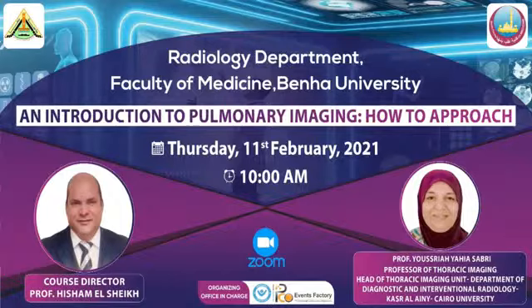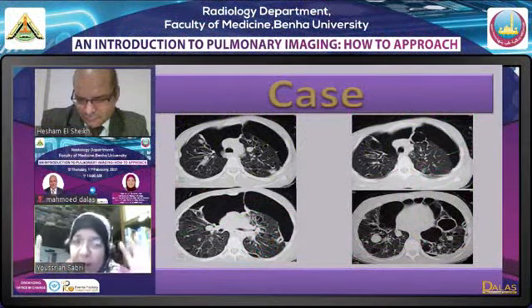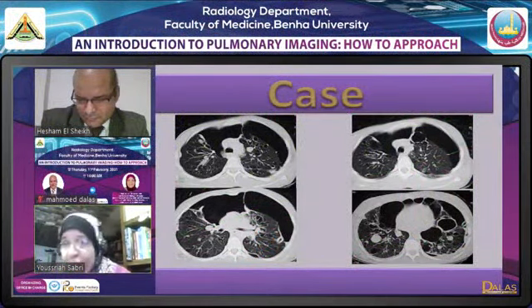طيب ايه تاني ممكن بايه بقى نفرق؟ ممكن نعمل بيت، ده هيفرق. ممكن نعمل حاجات فانكشنال ايمجنج، نعمل ديفيوجن ار، ده هيفرق وهيبين الانفلتريشن. خلاص، يبقى بالموداليتيز العاديه اللي هي السي تي العادي حتى بالصبغه والبلين اكس راي انا مش هفرق. عشان افرق سنترال ماس عامل اوبستراكشن ونتيجه لهذا الاوبستراكشن في كونسوليديشن في لانج كولابس او كونسوليديتد او وات ايفر لانج لازقه في هذا الماس، الحل الوحيد ان اعمل يا بيت سي تي يا اعمل ديفيوجن ايمج.